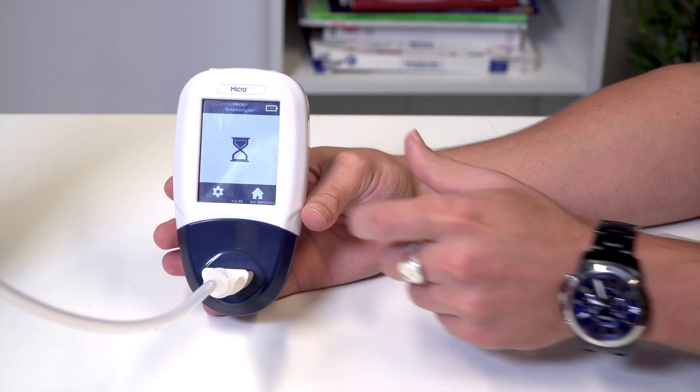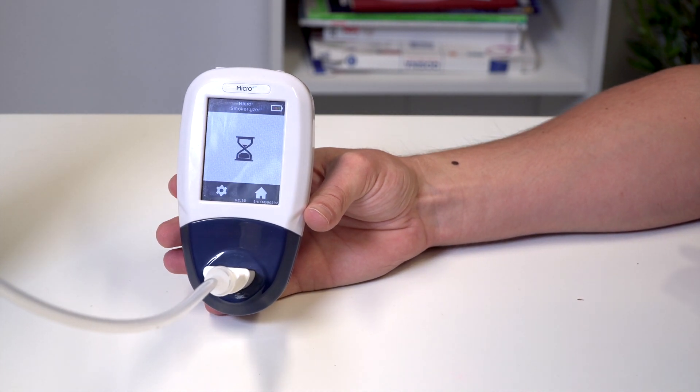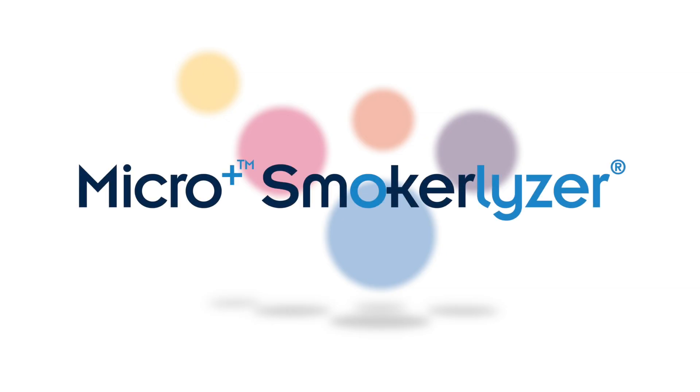Once the calibration is complete, press the home icon to return to the home screen.